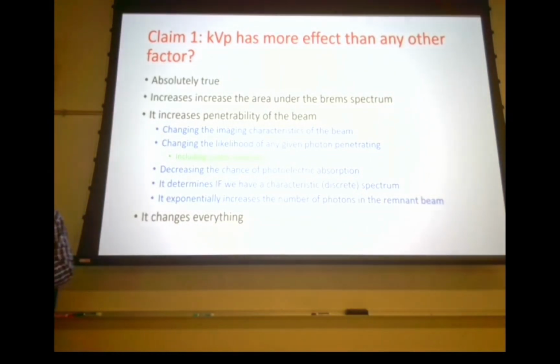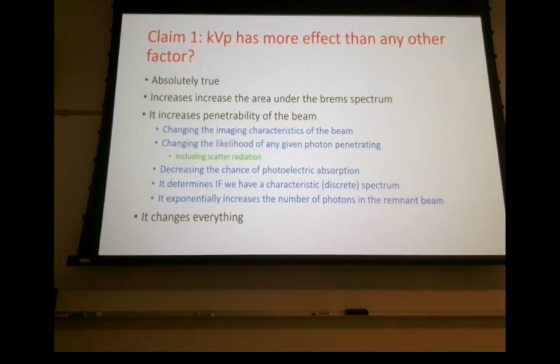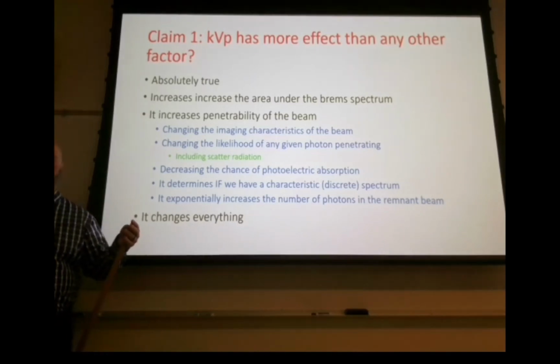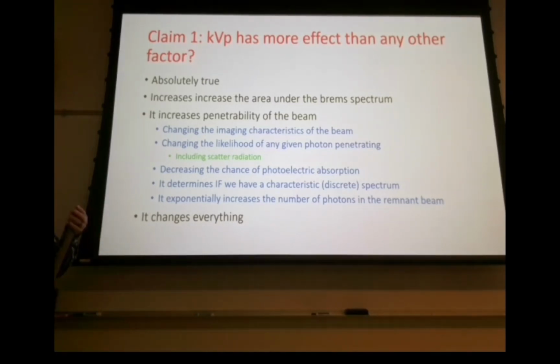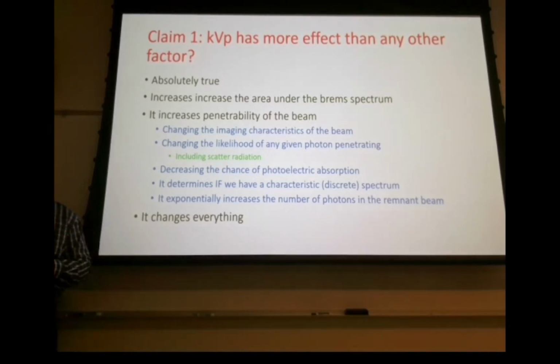But it also increases scatter, because the ones that could have been absorbed scatter around and get through. Okay, and we're going to get there in a minute. That's the sum of it. You know what a dichotomy is? You've got two different things that are kind of the same thing, but not really, or possibly even two things that are totally different but kind of the same thing. That's kind of what we've got going on here.